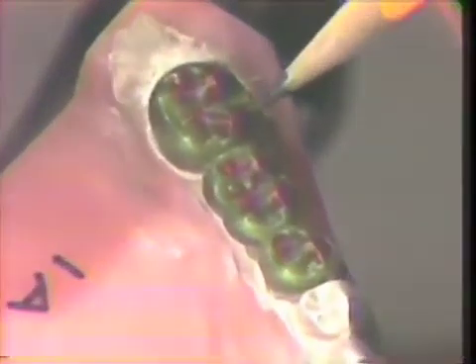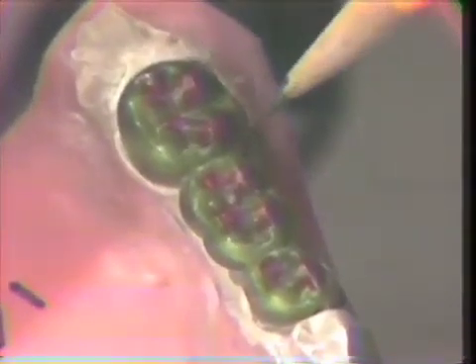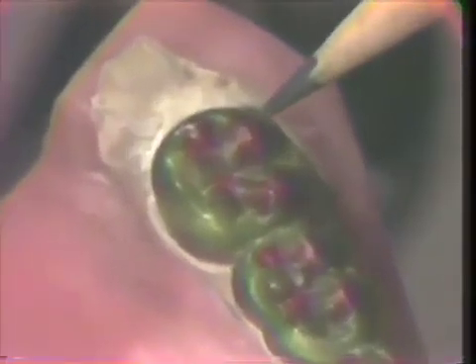You'll want to also go back and repool the centric stop areas. Whenever you carve the wax, there's a tendency to create either a flat surface or a concave surface. And rather than having that, you want a convex surface in the wax in the final casting, therefore also in the wax pattern. So now, following removal of these interferences, the wax pattern has been cleaned up. You'll want to readapt your margins, pull the pattern, sprue it, and cast it. And then come back with the casting and adjust the casting, not only against the anatomical, but against the stone functionally generated pattern also.